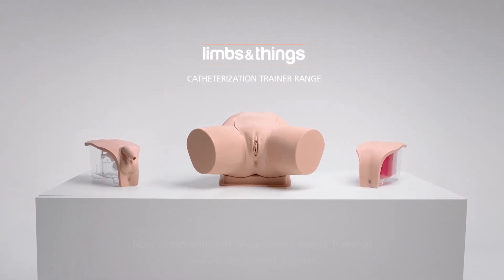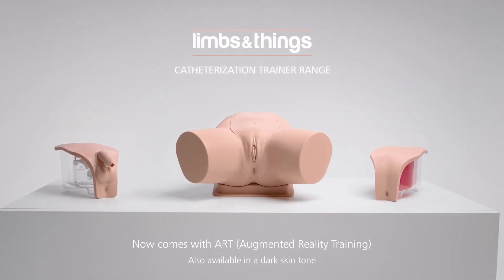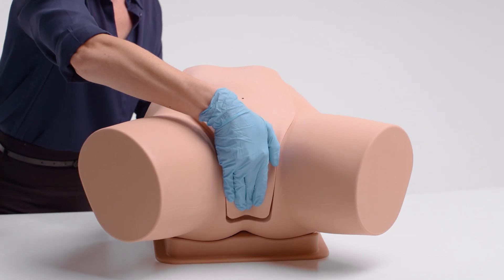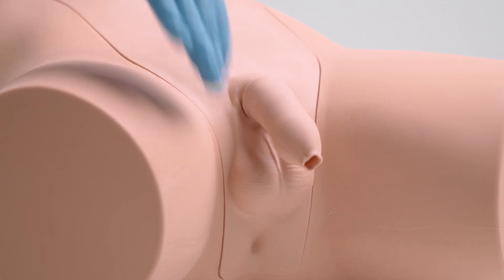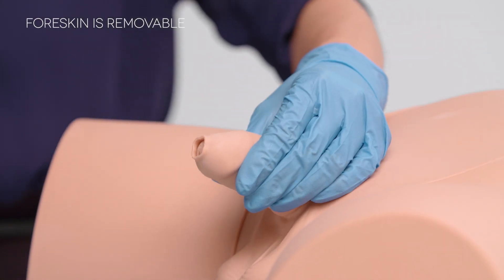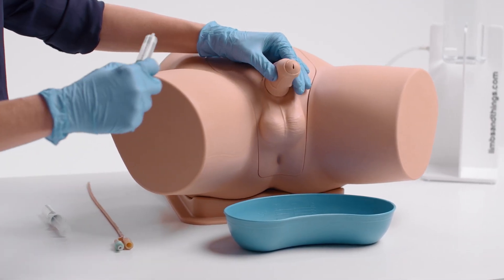Introducing the latest urinary catheterization range from Limbs & Things that caters for all levels of catheterization training. The fundamental procedure of male and female catheterization can be taught by using our interchangeable modules. The anatomically accurate modules include a supple urethra and resistant sphincter, providing a closer-to-life training experience.